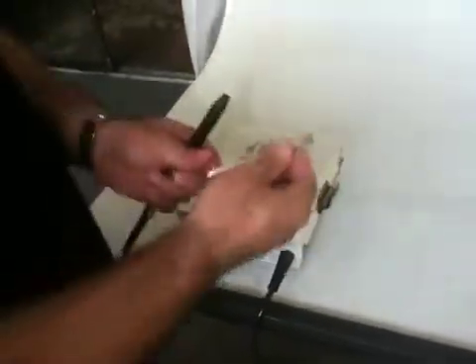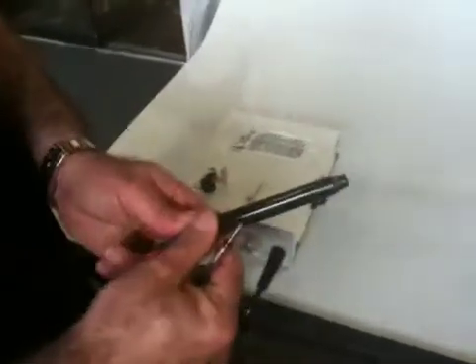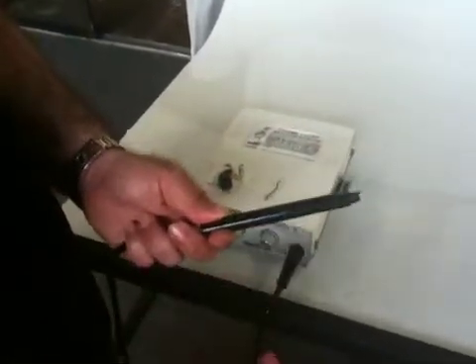This is a short video on how to insert the Sonus transducer stack into the Sonus handpiece without damaging it, and how to properly remove it.